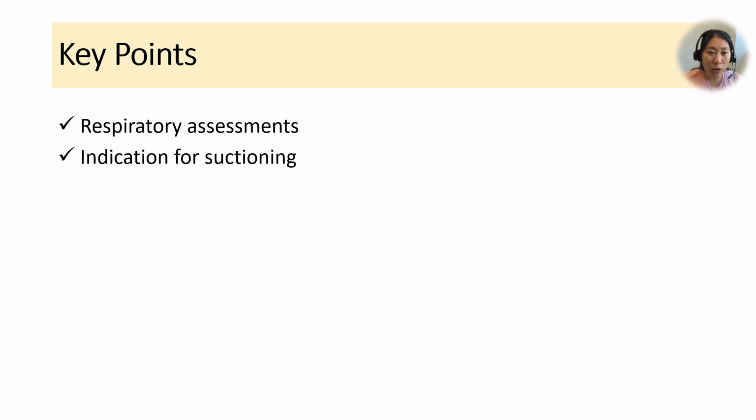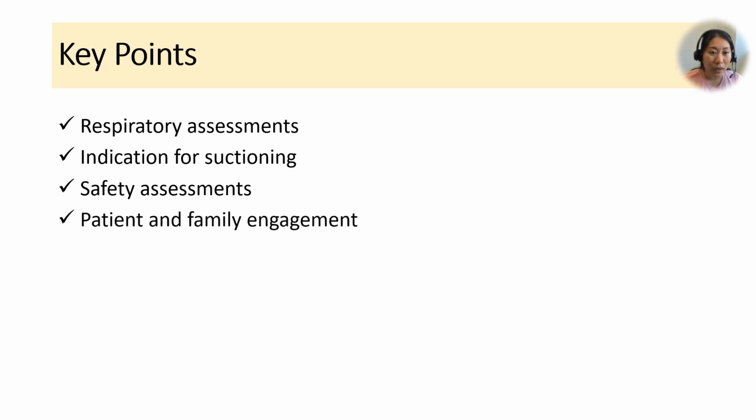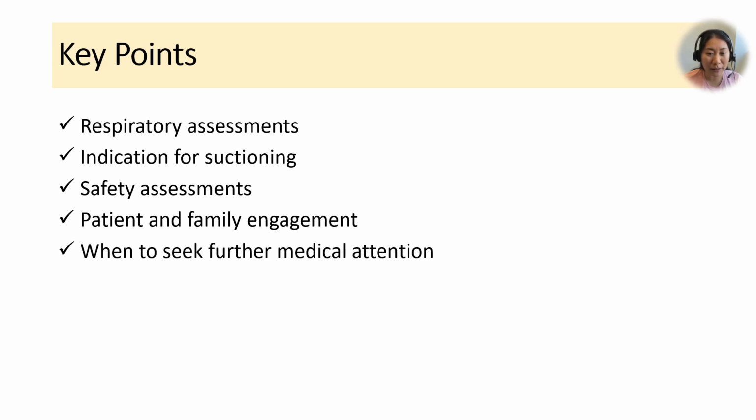Know why the patient requires suctioning and if this is still needed regularly throughout the day or only if needed. Make sure you have checked that all of your equipment is working and the suction pressure is set to the correct setting. Involve the patient and family in care, whether that is identifying the need for suctioning, learning how to suction, or providing comfort. And know when you need further support or medical attention.